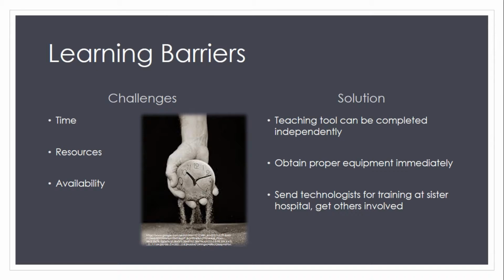Our last challenge was a matter of availability. In ultrasound, we often practice on one another to hone in our skills. If we need to work on kidneys, we can grab a partner and scan their kidneys. However, no one in the department has a neonatal head. Ultrasound cannot penetrate or see through bone, so an adult brain cannot be imaged. In fact, an infant of 6 months is even too old to image because the fontanelles or soft spots have fused and become solid bone by then.